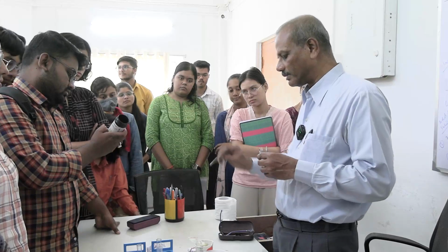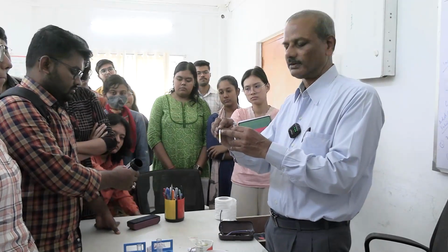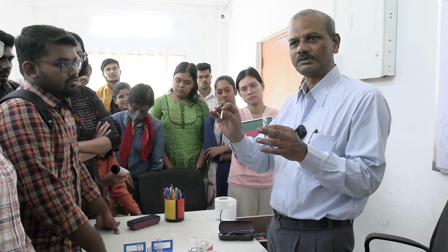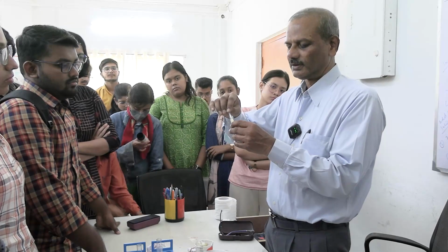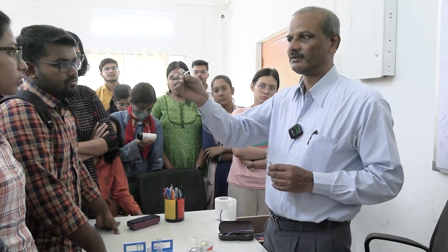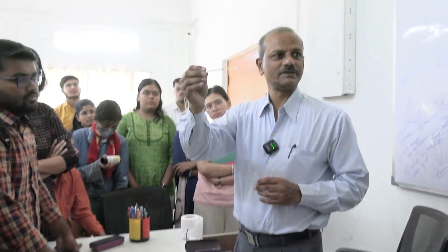Now here the glucose mark is this one. So we have to observe the change of color of this bluish part, whether there is a change in color or not. If there is no change in color after 30 seconds, that means there is no glucose. If the color changes, then the glucose is there. So right now I am dipping it. Can you see the color change?